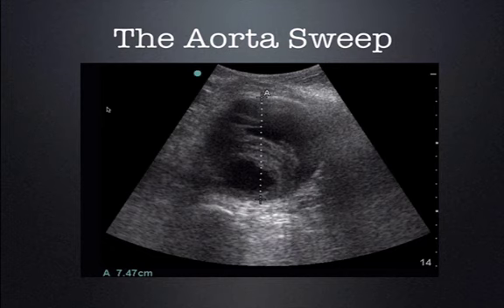I think it is helpful to at least go ahead and measure this so you can relay this to your surgical colleagues. Detailed discussion on evaluating AAA is beyond the scope of this presentation, but suffice it to say, the calipers are measured from outside wall to outside wall.